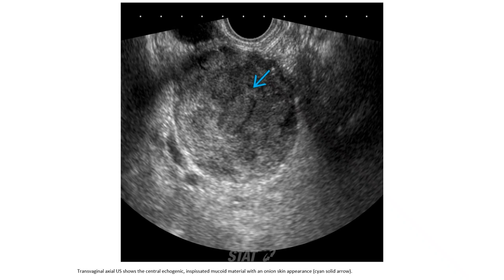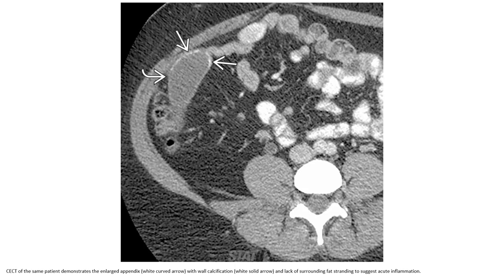This is the CT scan image showing the central lumen with specific mucinous content and an onion-skin appearance. This is the upper end of the appendiceal mucocele. Contrast-enhanced CT of the patient demonstrates the enlarged appendix with wall calcification and lack of surrounding fat stranding, which suggests no active inflammation.